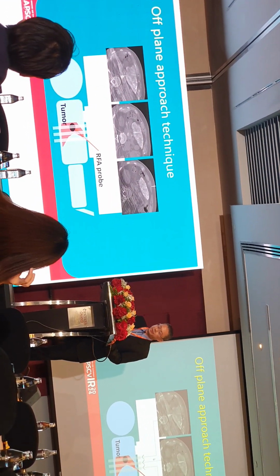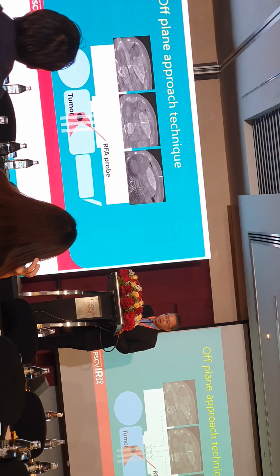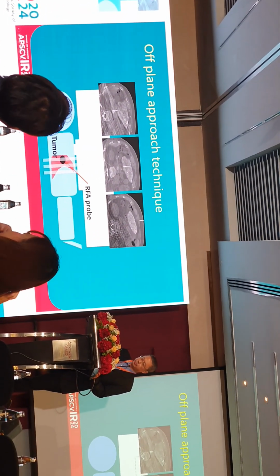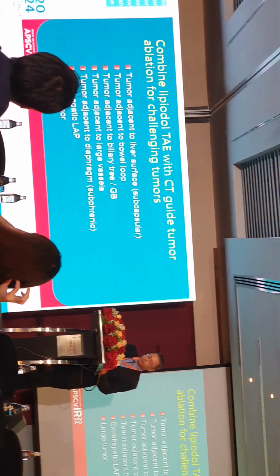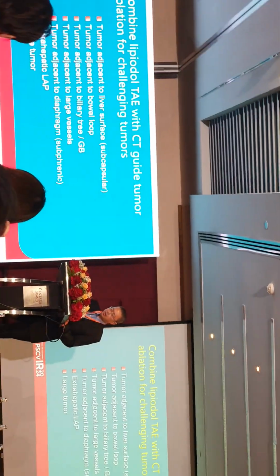Another technique is the off-plane approach. If the lesion is just posterior to the vessel and we want to avoid vessel complications, we must be familiar with the off-plane approach from inferior to superior to approach the tumor. So I will show some challenging cases under this combined treatment.